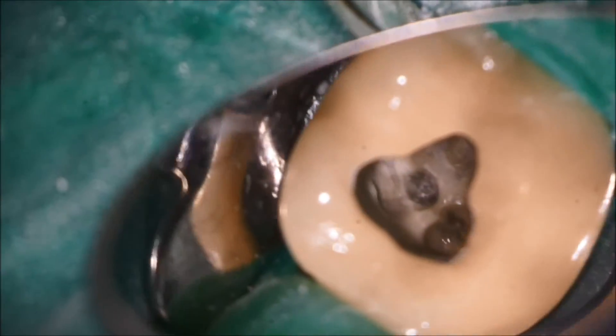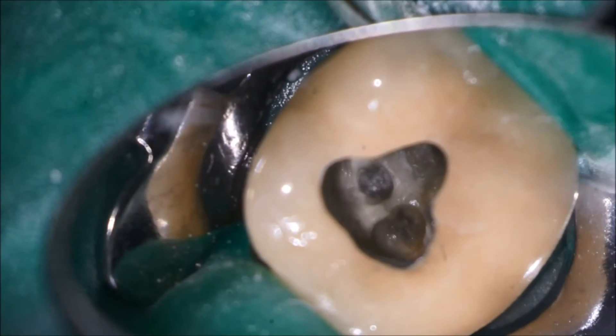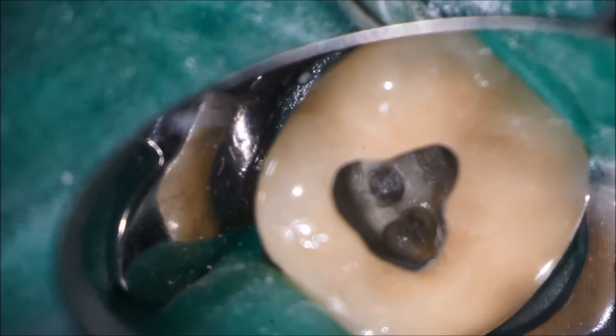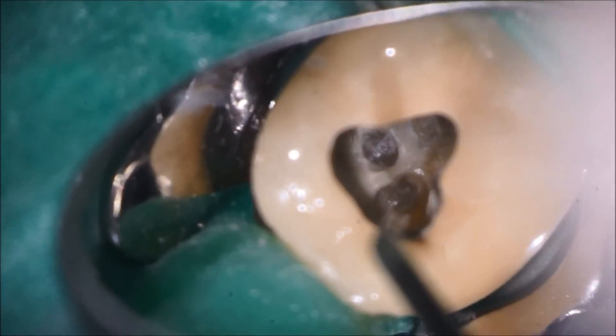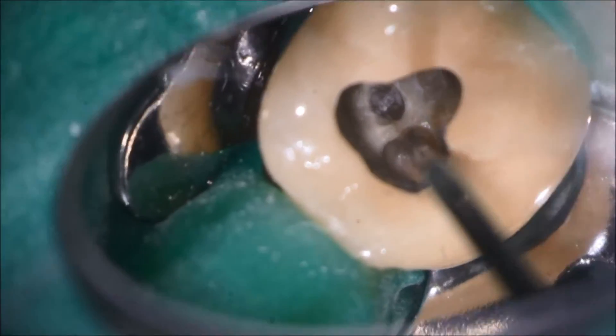Dentinal chips will stick in the canal, giving you a clue where to begin to explore. Examining the pulpal floor under a dry condition and a wet condition are both very helpful in finding calcified canals. The microscope allows you to see very subtle changes in the coloration of the dentin, which lead you to the canals.